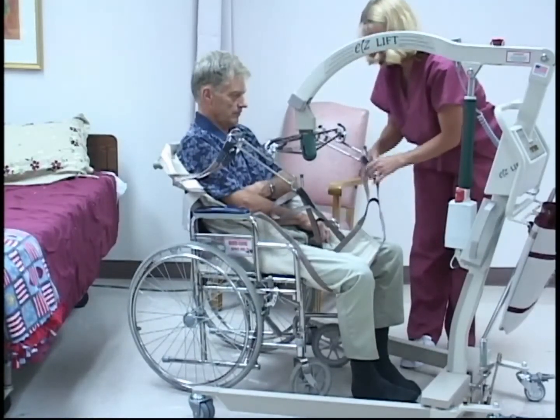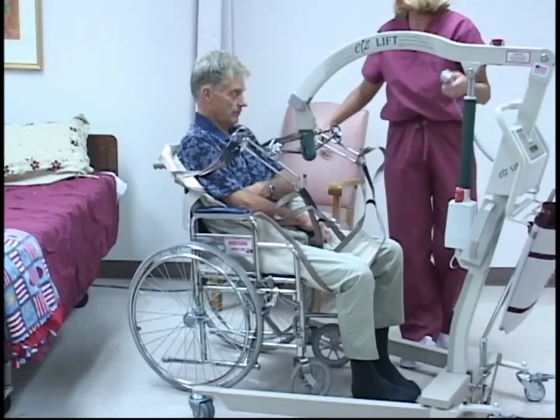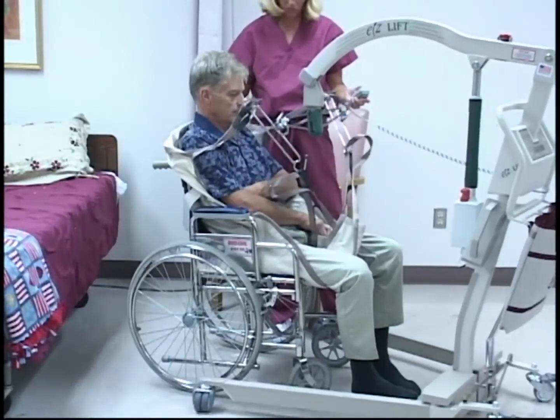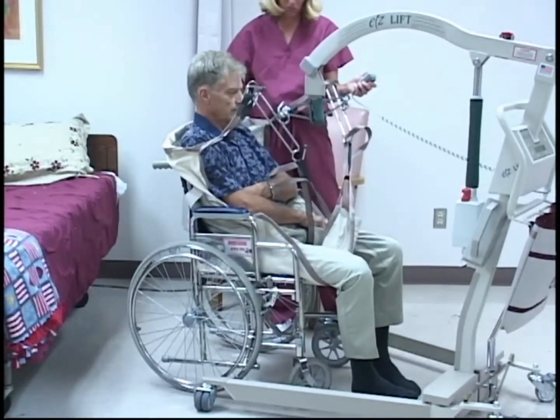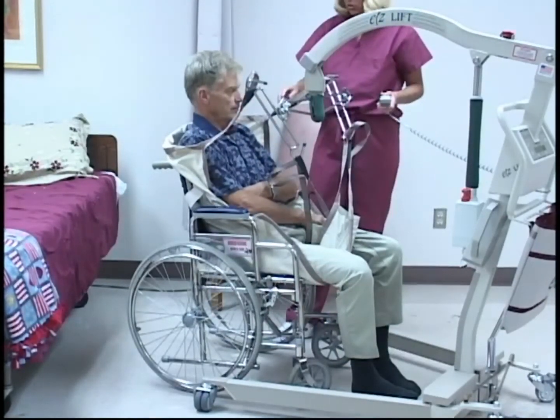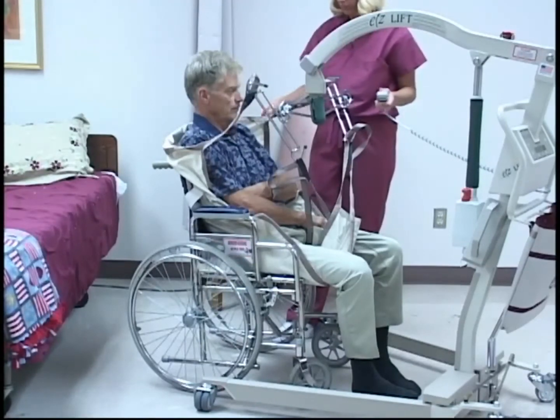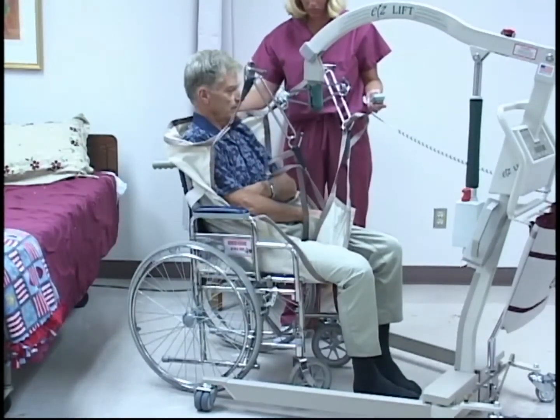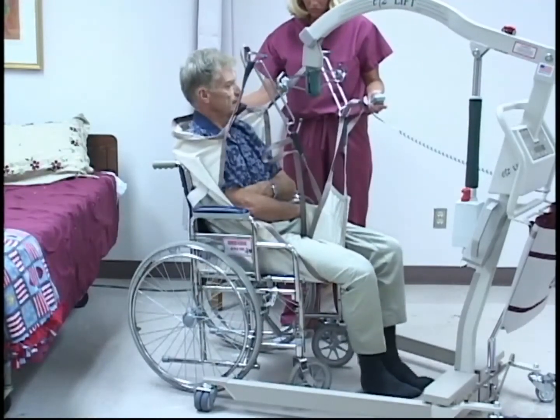Take the right leg wing and attach it to the left hook using the middle loop. Take the left wing and attach to the right hook using the middle loop. Push the button on the hand control. Lift until there is tension on the wings of the sling, making sure all of the loops on the sling are securely hooked on the sling hanger.